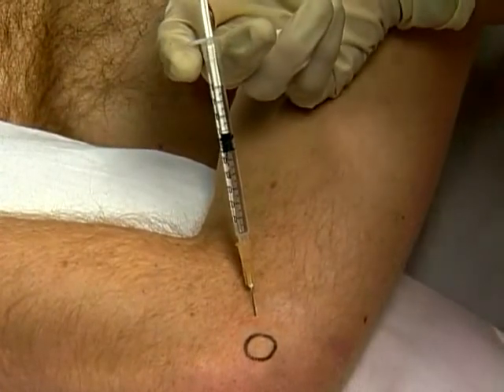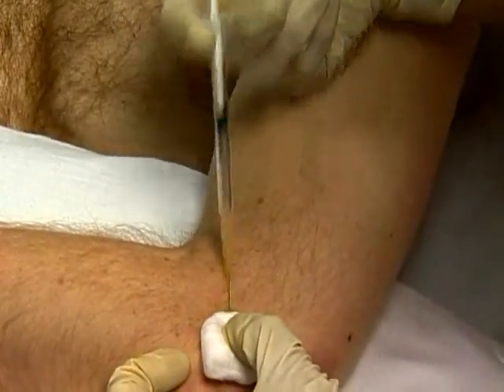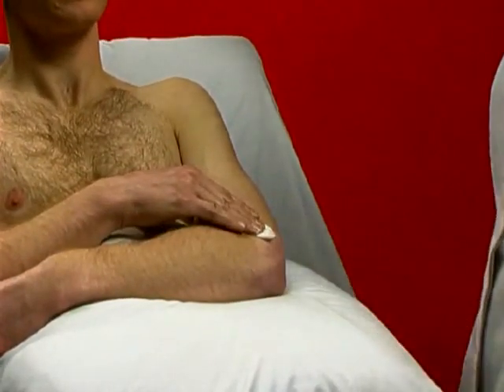When the syringe is empty, press cotton wool firmly around the needle and rapidly remove. Dispose of syringe and needle safely into Sharps box.